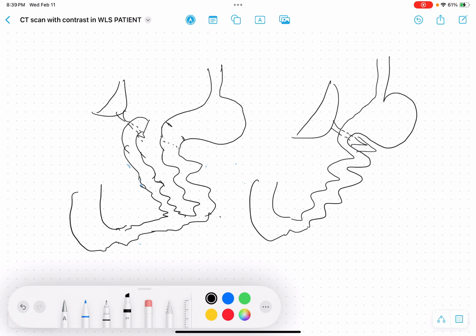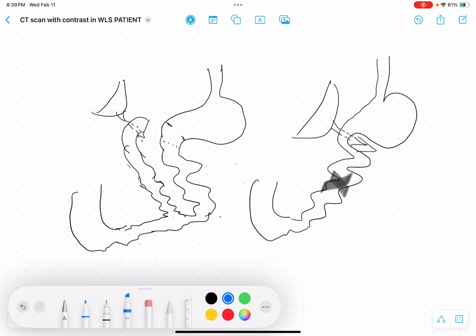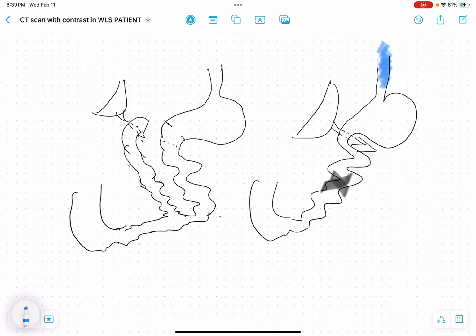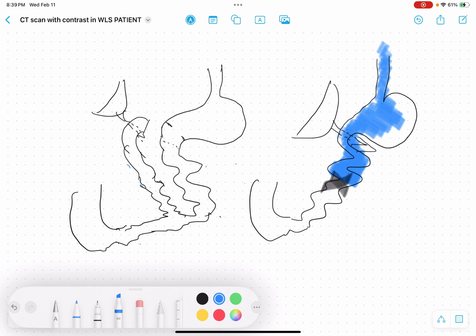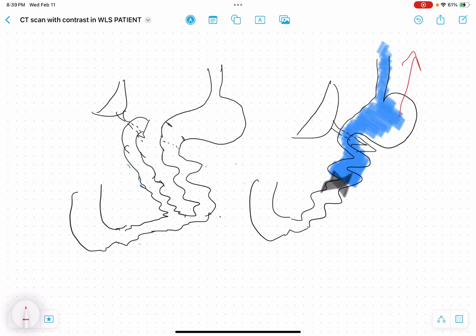So when we look at this, let's now go to a blank anatomy. And let's say there's a patient here that has some sort of an obstruction, all right? And that obstruction may be a tumor, an adhesion band, an internal hernia where the bowel is twisted by itself, and so forth. So when a patient with normal anatomy has some sort of a blockage, the contrast will go down the esophagus to the stomach. It will sit there and dilate, and since it can't go anywhere, the x-ray will be fairly clear, and this patient will have significant nausea and vomiting, projectile vomiting through the mouth.